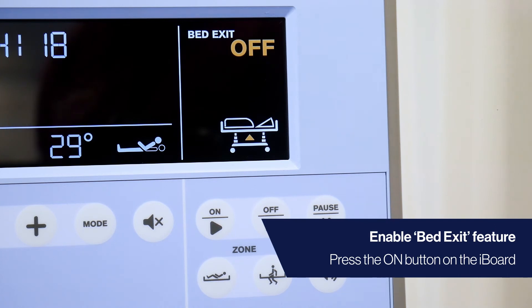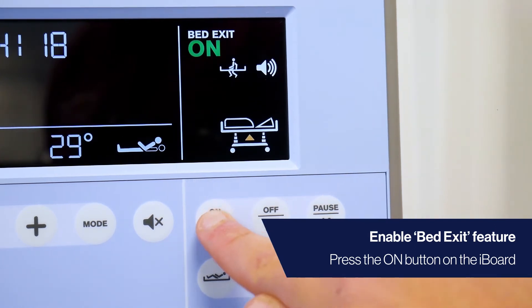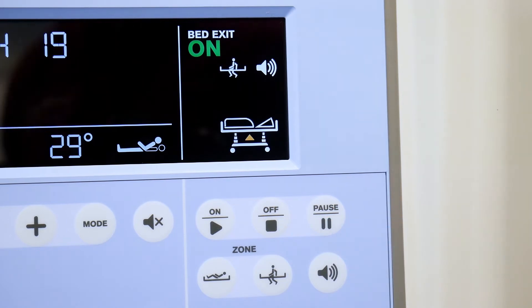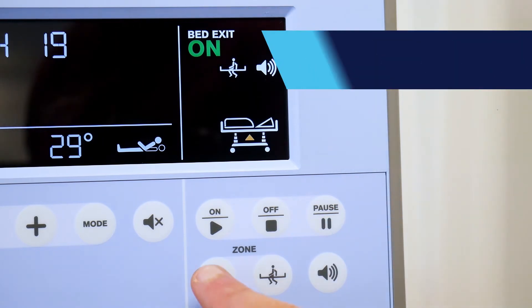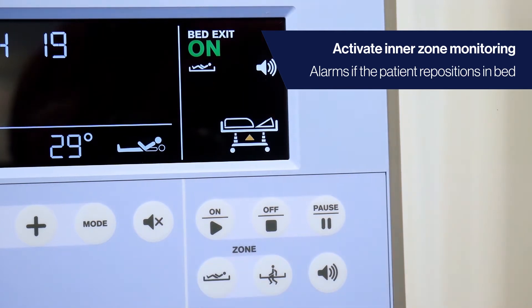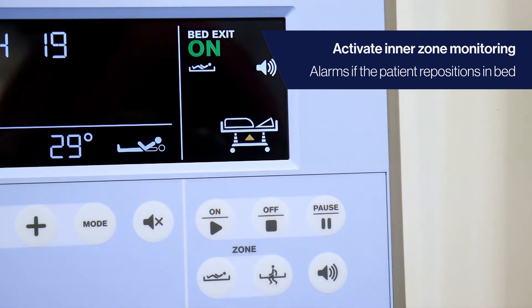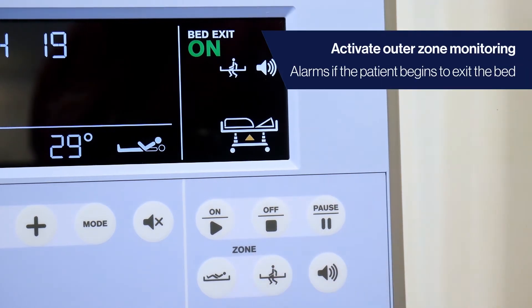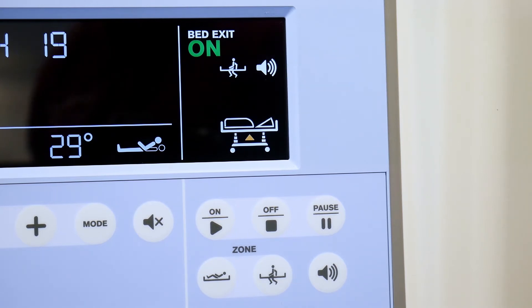To activate the bed exit monitoring feature, press the on button located on the iBoard. The monitoring zone can now be selected. Press and activate the inner zone button to alarm if the patient repositions in bed. Press and activate the outer zone button to alarm if the patient begins to exit the bed. Note that the scales must detect a weight reduction of 20kg or more for this to happen.